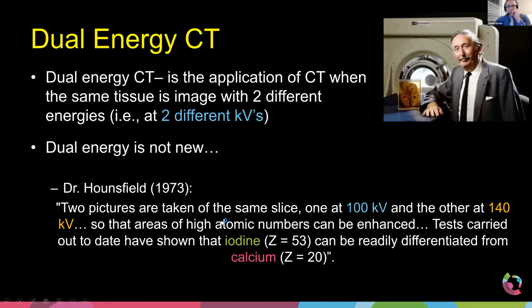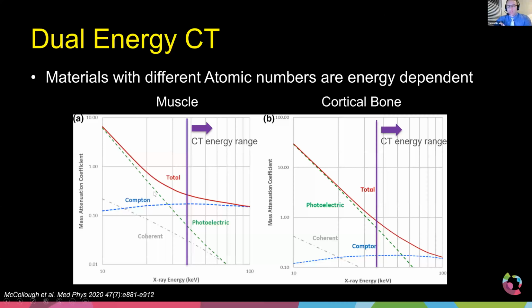And so dual energy CT has actually been around for a very, very long time. The only reason we've only started using it now is because CT scanners weren't powerful enough back in the day, nor were the computers really capable of doing the reconstruction. So really, dual energy CT, as we know it, actually began in about 2006. And that was when the first of the various CT vendors introduced a CT scanner. Siemens was the first to introduce a dual energy CT scanner.